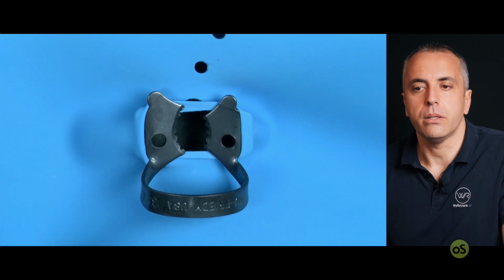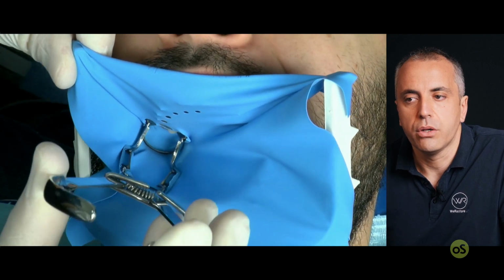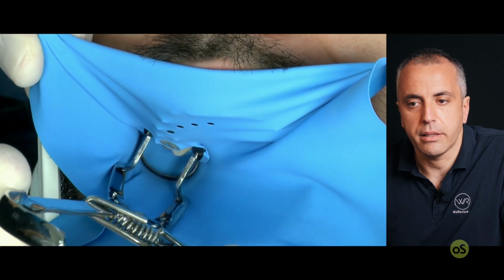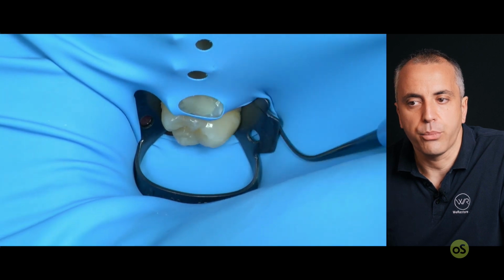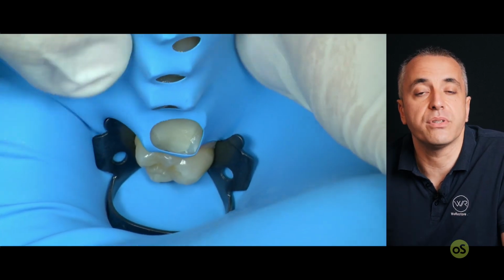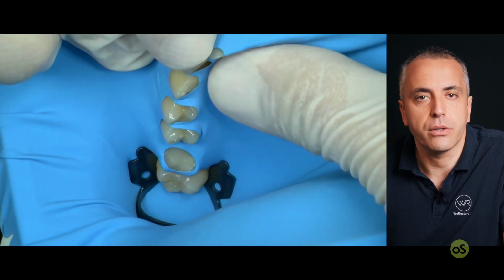As already mentioned in the lecture about isolation, this is a single operator isolation. So we go in the mouth of the patient, we put the clamp and the rubber dam, and most of it is done. Then we take our posterior instrument to move the rubber dam from the wings. Of course, you can also use the spatula from the 3 Essential We Restore kit.